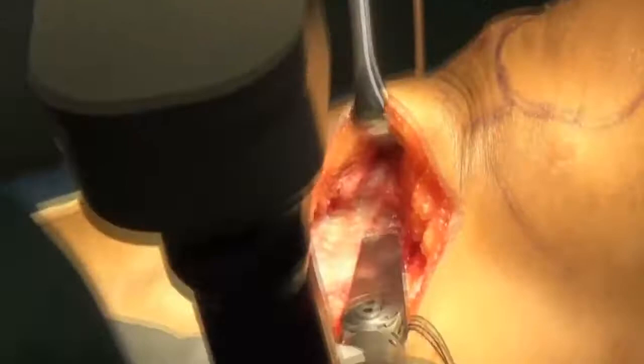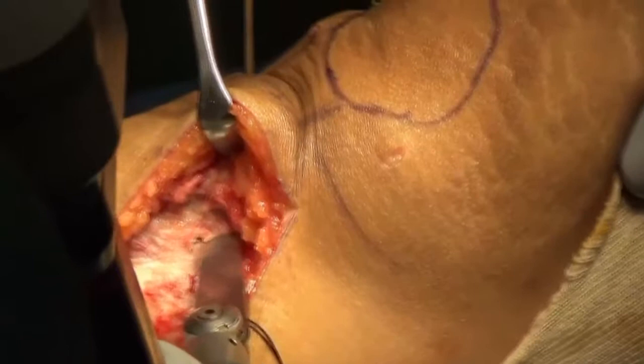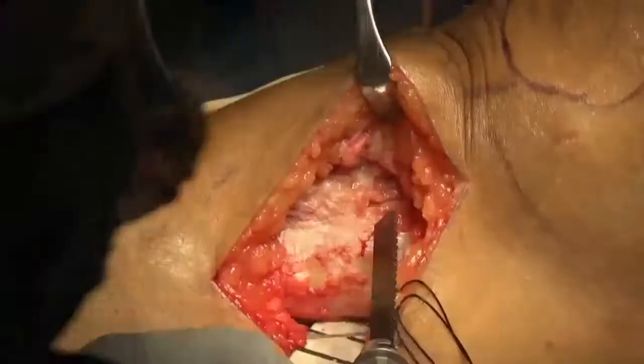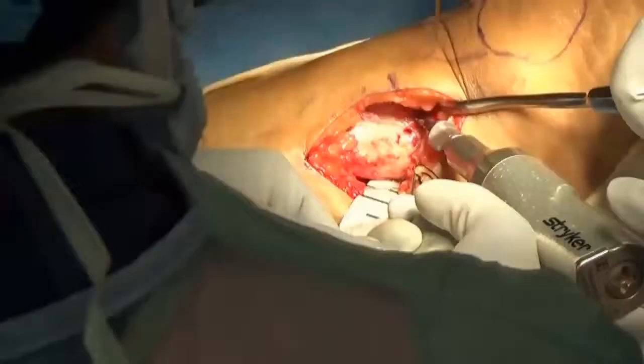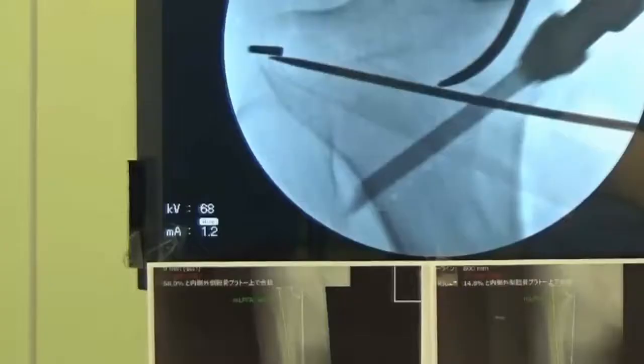The descending osteotomy is begun 15 millimeters posterior to the tibial tuberosity using a small oscillating saw. A small sagittal bone saw is then used to cut between the guide wires at the proximal end and the arc of dots at the distal end, shown under fluoroscopic guidance.